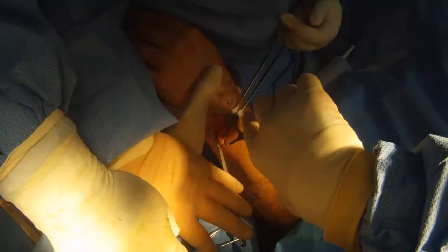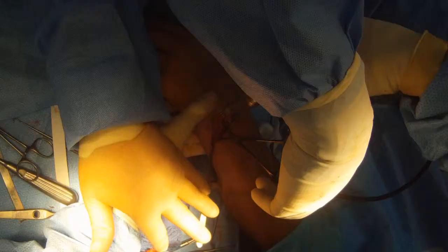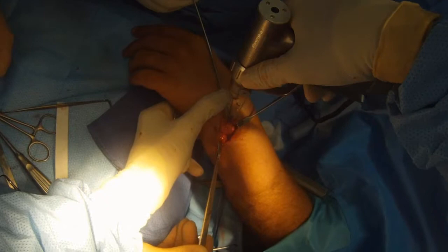Remove the wires. Use a towel clip to collapse down the osteotomy. Now I'm going to drill a guide wire for the first screw, which holds the osteotomy shut.